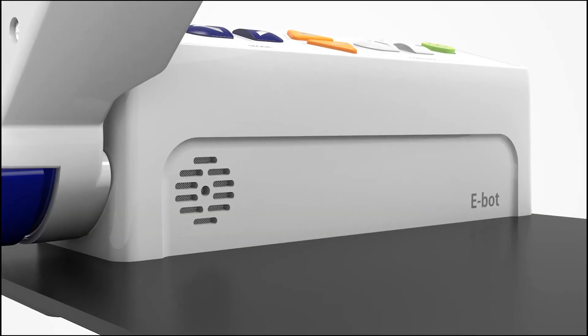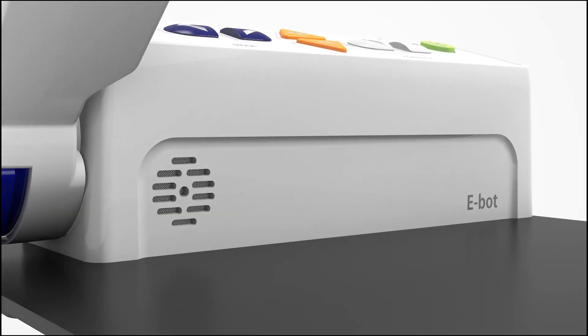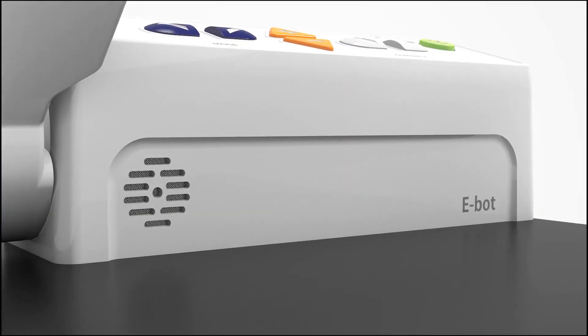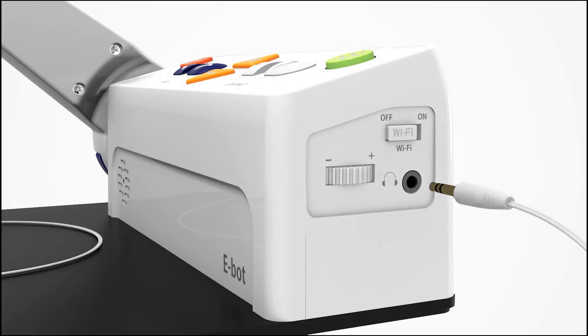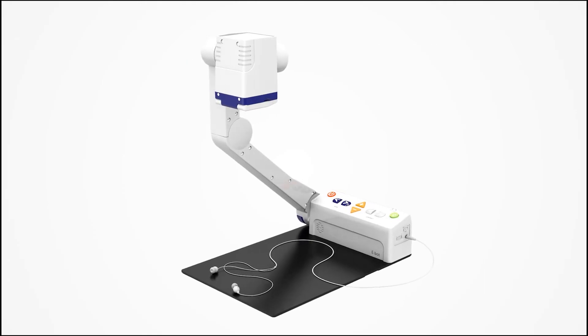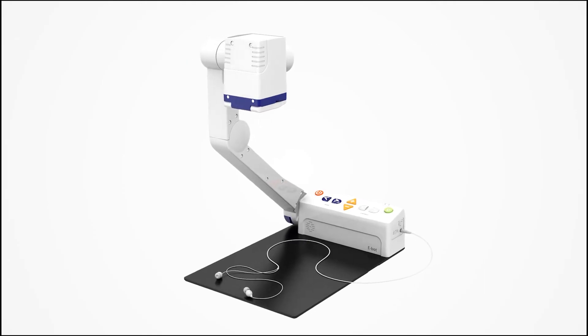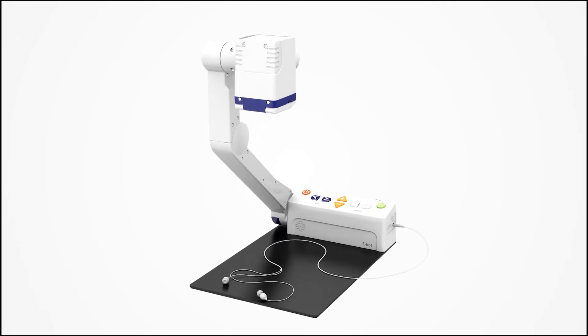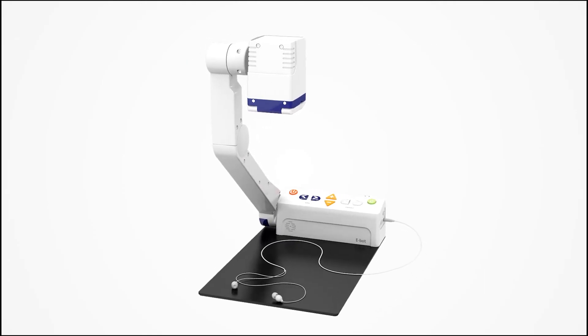eBot offers both internal speaker and headphone output, ensuring optimum usability in a variety of situations.